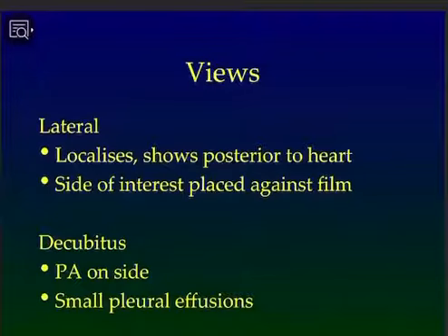Lateral view is done either from the right side or from the left side, depending upon the site of pathology. And the advantage of lateral view is that it localizes the pathology, especially which is posterior to the heart. Because any pathology which is behind the heart will not be visible on chest X-ray PA view.